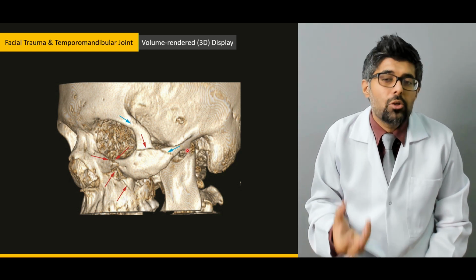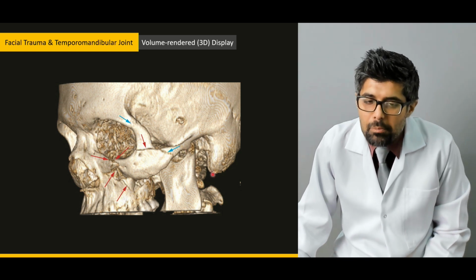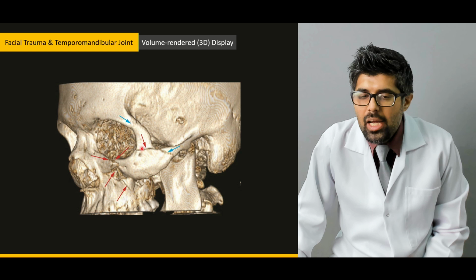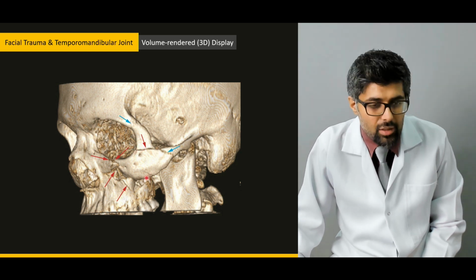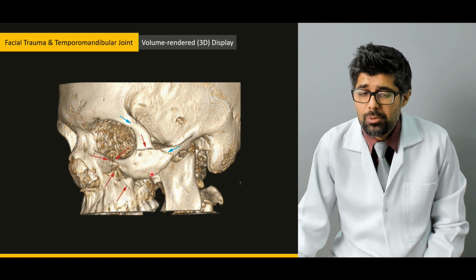Now, this can only happen in one of the newer CT scans, not in the older ones. So it's a relatively newer technology, but it gives the doctor a very clear picture of where the fracture lies, and it also eases up the patient as to where his problem is and how to tackle it and how to make a better judgment about his or her treatment.